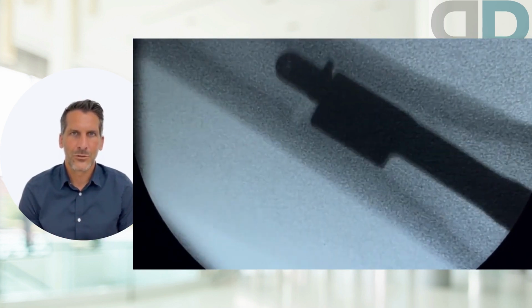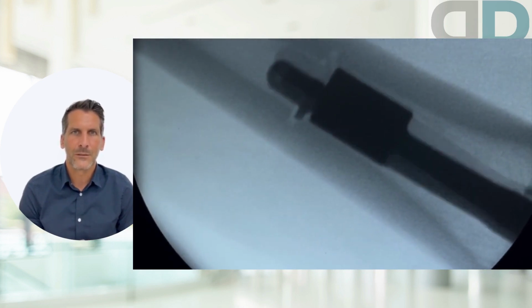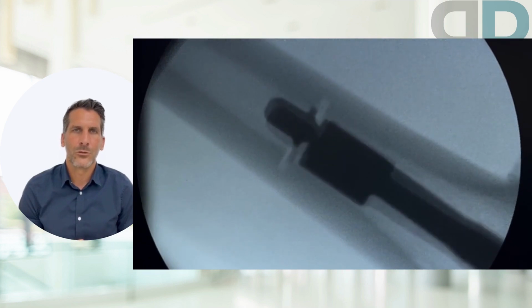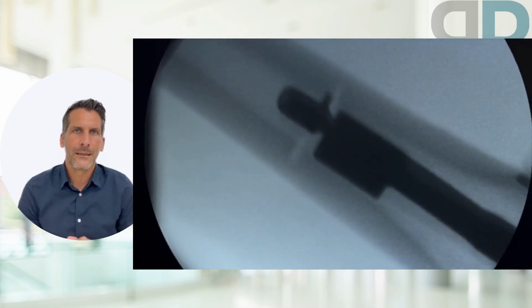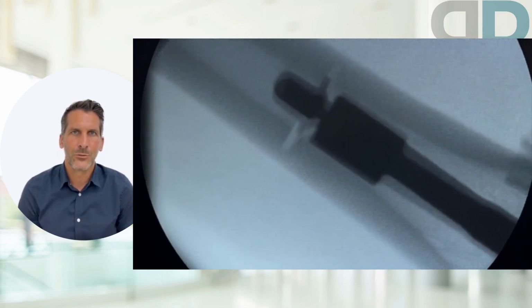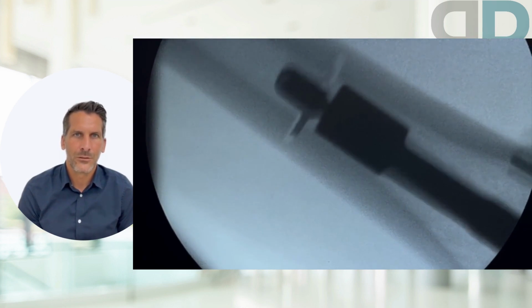On the X-ray image, you only see a two-dimensional representation. In reality, however, the bone is round and hollow inside like a tube. The saw is placed in the medullary cavity, and through slow manual rotational movements, the bone is gradually thinned from the inside, in a circular manner, at the level of the saw blade. The saw is then unfolded and repeatedly changed to a larger blade until the maximum is finally reached.